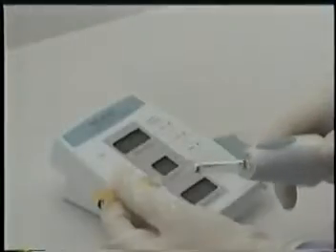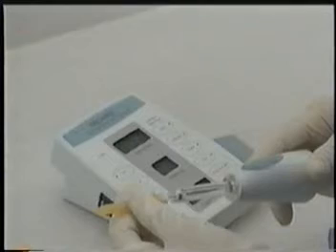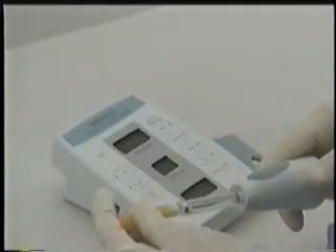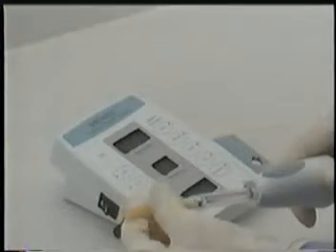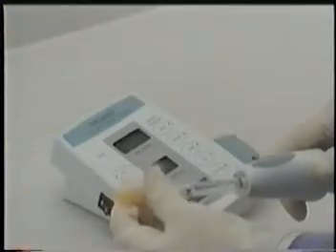cartridge. Select an appropriate standard disposable needle for the injection. Remove the rear cap and screw it onto the cartridge sheath, just as you would attach it to a standard dental syringe. Leave the front needle capped until you are ready to administer the injection.